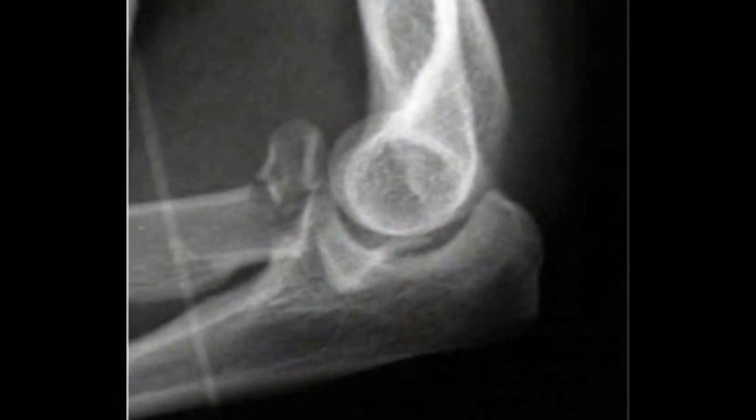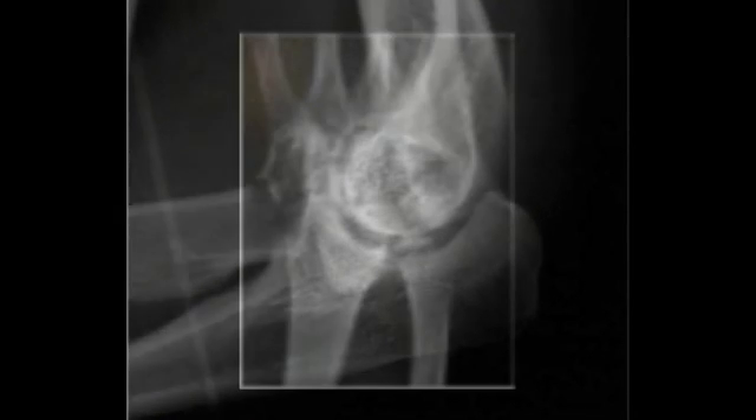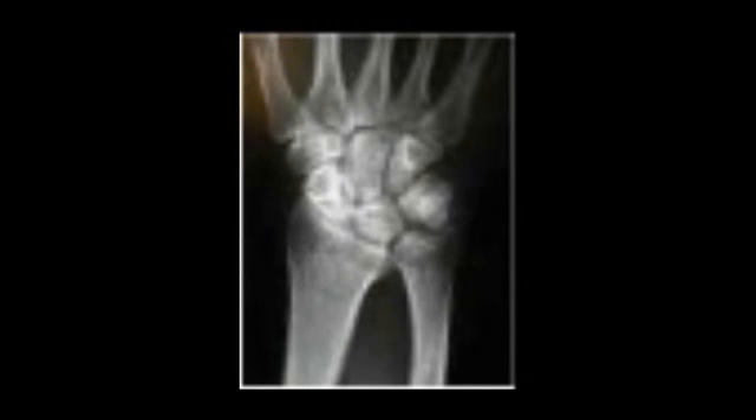On this x-ray, we see that it's an elbow. We see that there is a fracture of the radial head. Now, looking at this other x-ray, this is the same patient.